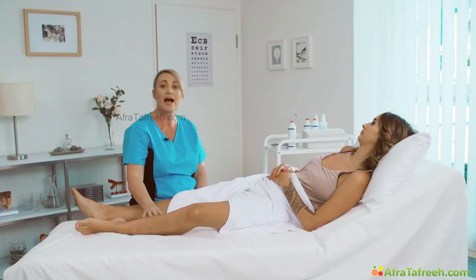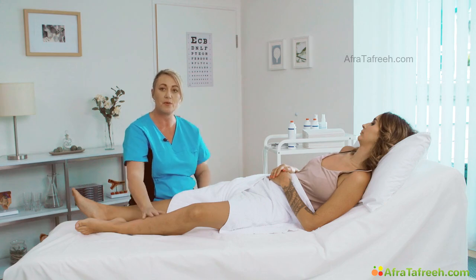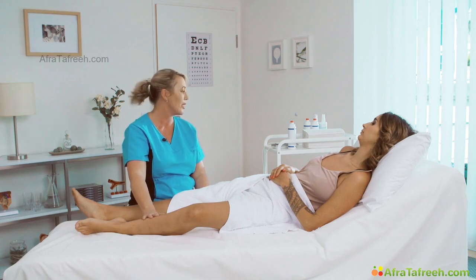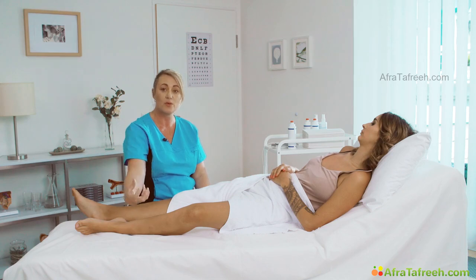In order to see the calf veins more easily, I've repositioned the patient with the back of the bed slightly upright. This will help the veins to fill with more blood and hopefully make them a little bit easier to see. You can also have the patient sitting on the edge of the bed with the legs hanging over the side. This will also help to fill the veins better.